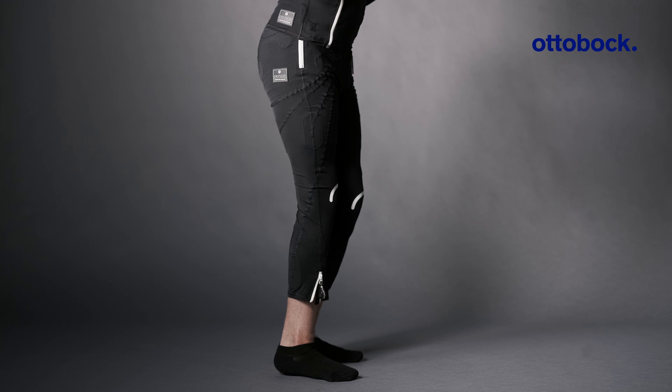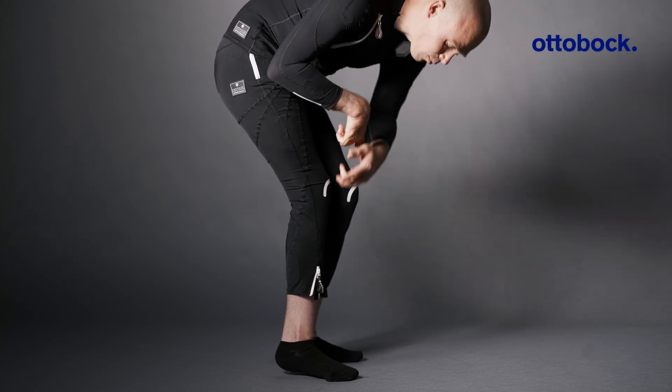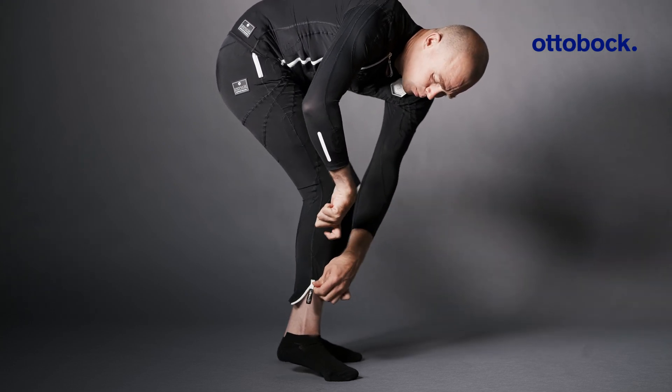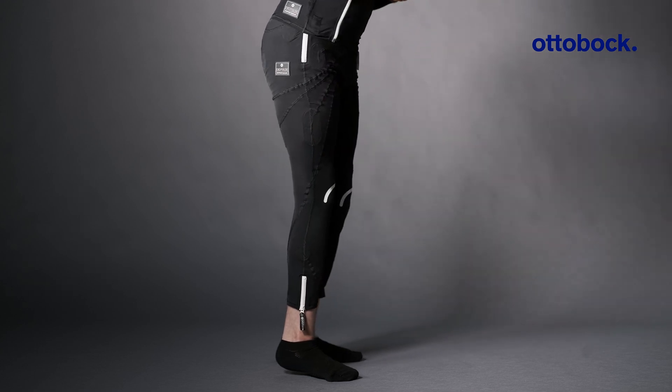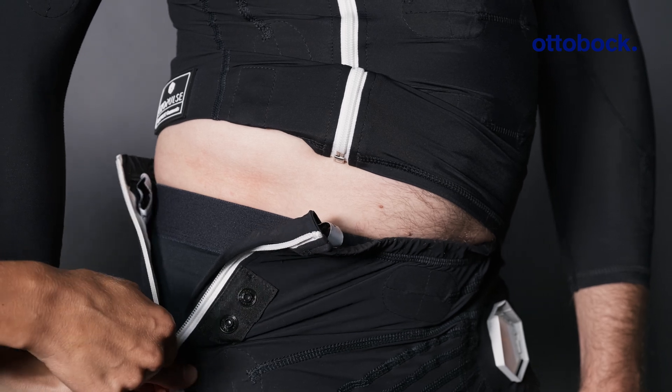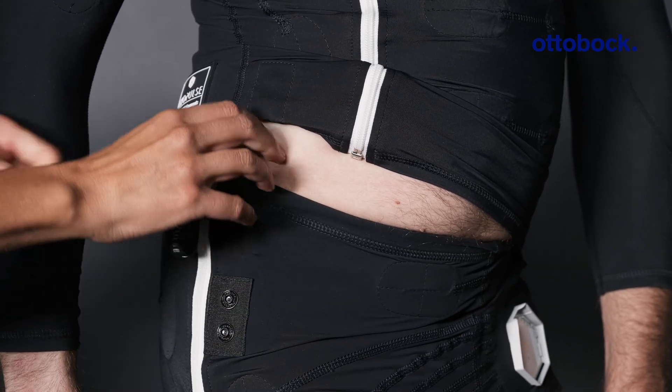Adjust the leg zipper so that it is on the outside of the leg and runs in a straight line from the ankle to the hip. Then close all three zippers, as well as the secure button at the hip.